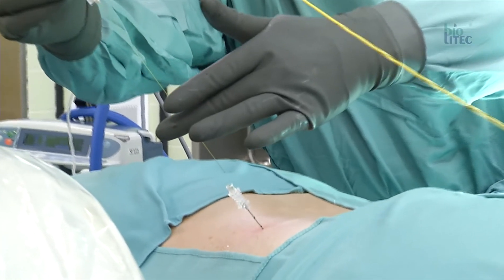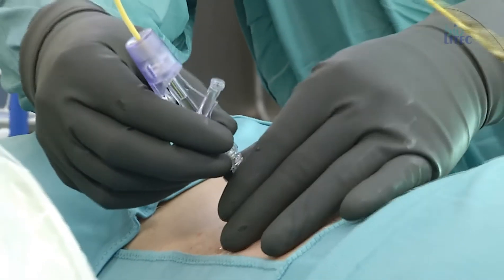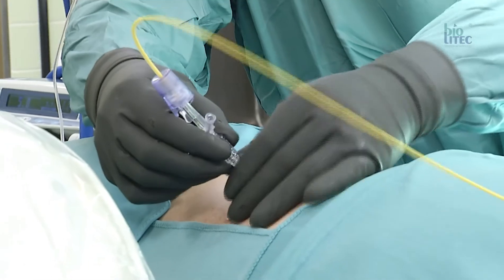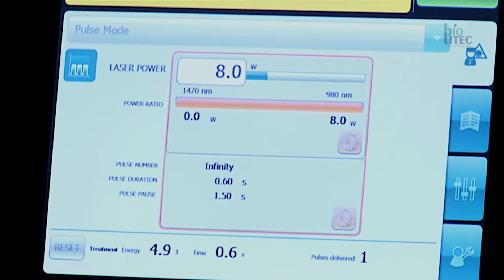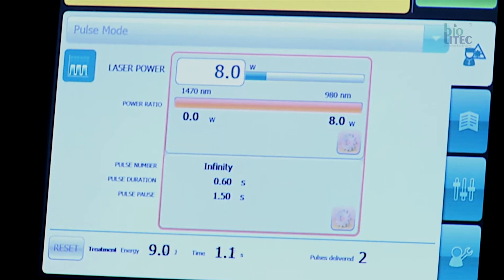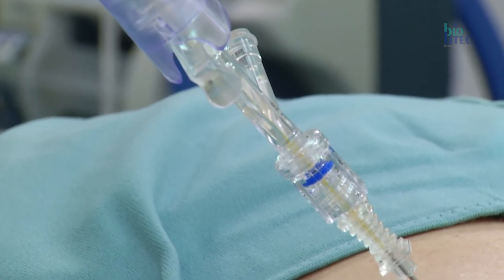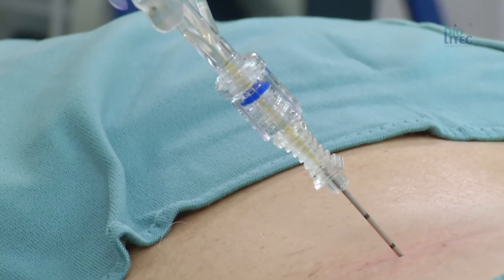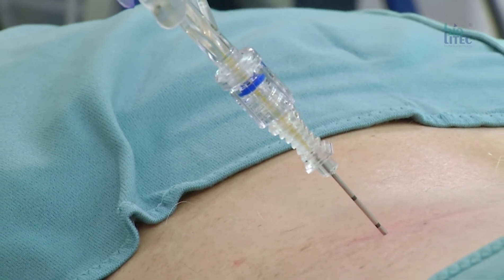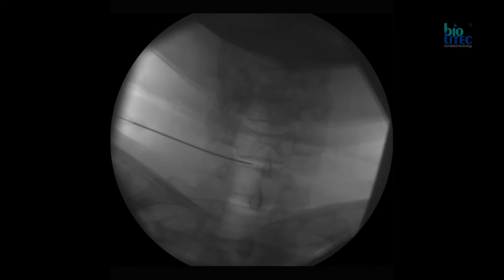After the correct needle placement, the glass fibre is inserted. The fibre overlaps the tip of the needle by 2mm. After adjustments, the laser is started in pulse mode. For the cervical spine, a 20g needle and an anterolateral approach are used.